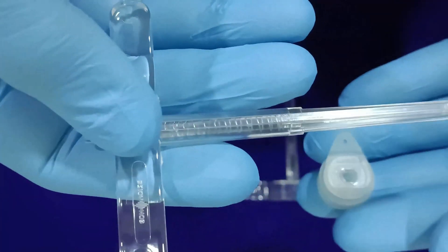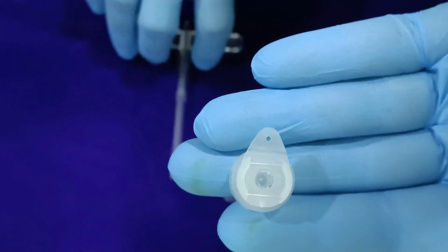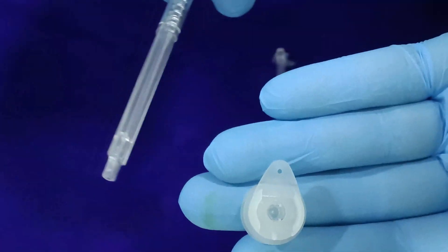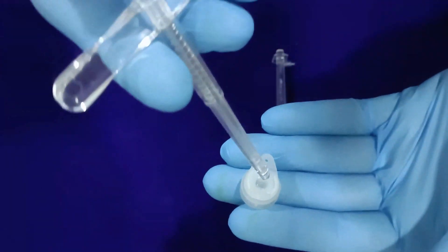The voice prosthesis is now well positioned for action, allowing the patient to speak by occluding the stoma and blowing air from the lungs through the inside of the voice prosthesis and through the throat, creating a voice sound which is called tracheoesophageal speech.